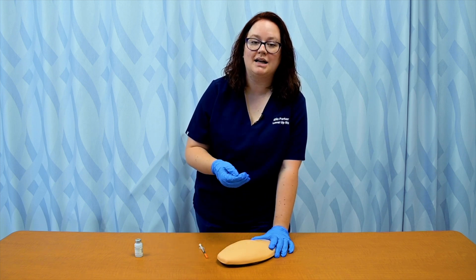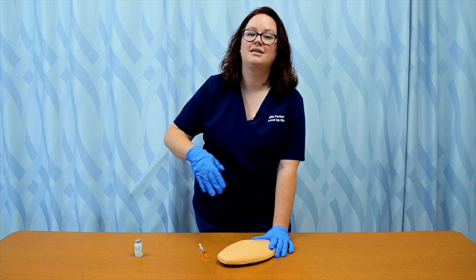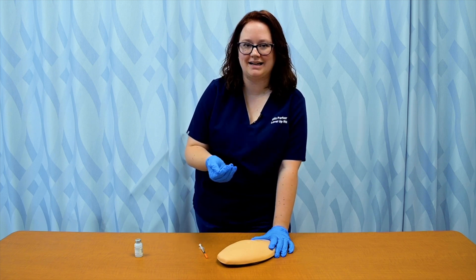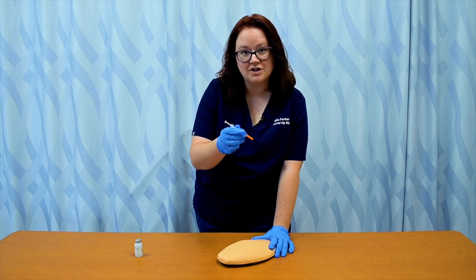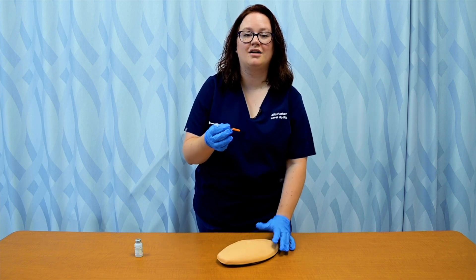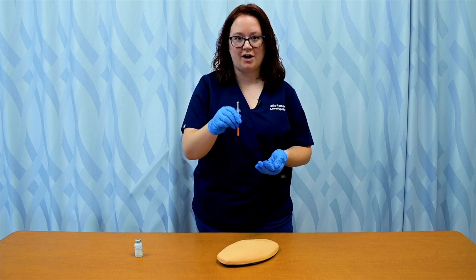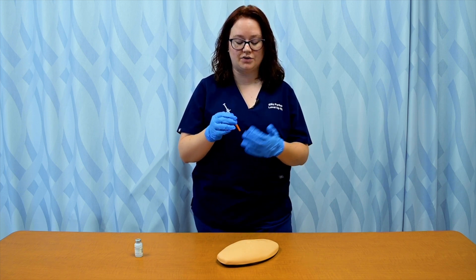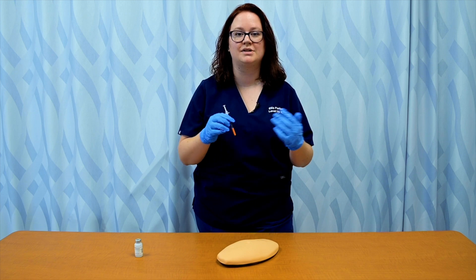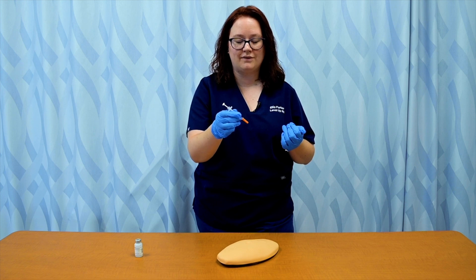If my patient has at least one inch of pinchable fat, I can go in at a 90 degree angle. If they do not have the extra subcutaneous fat, I'm going to want to go in at a lower angle — 45 degrees — because if they're not blessed with extra subcutaneous tissue and you go in at 90 degrees, you have an increased likelihood of hitting the muscle. You don't want the needle to go into the muscle, as this medication is for subcutaneous injection. So you may want to decrease that insertion angle if needed.